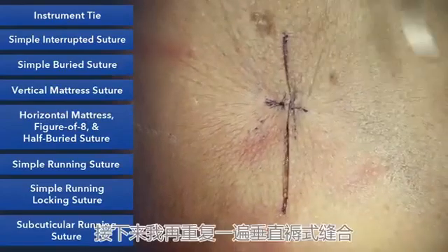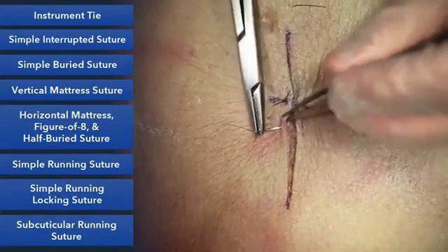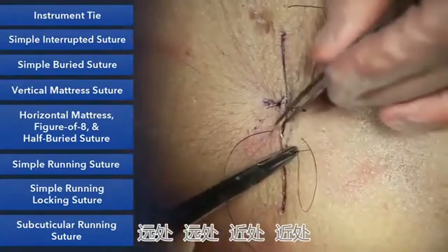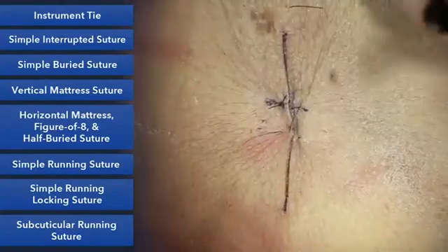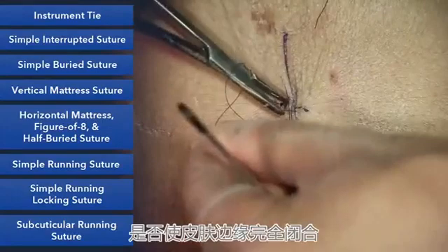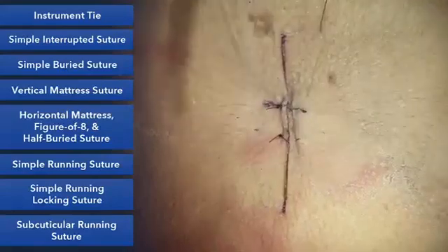So I'll show you that one more time. The vertical mattress suture. Far, far, near, near. And as you tie it down, decide how much tension you need to evert your skin edges and hold things together. And that's your vertical mattress.